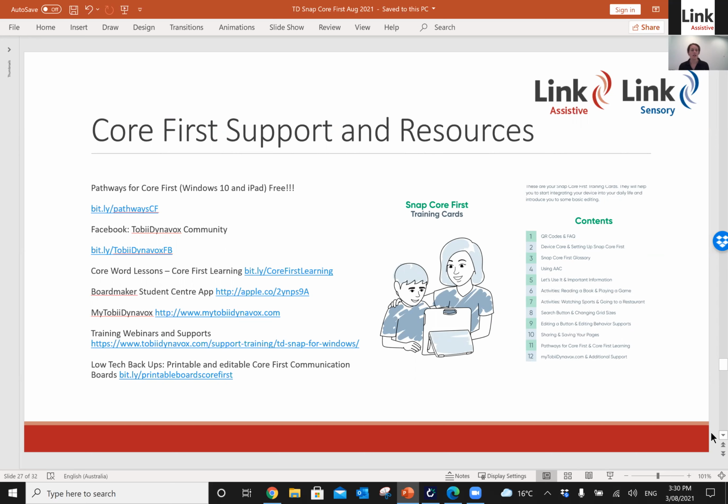Back to the goal around communication partners and trying to make things as easy as possible for people. There's a getting started guide, quick training cards. If you haven't come across those yet, I'll quickly show you.